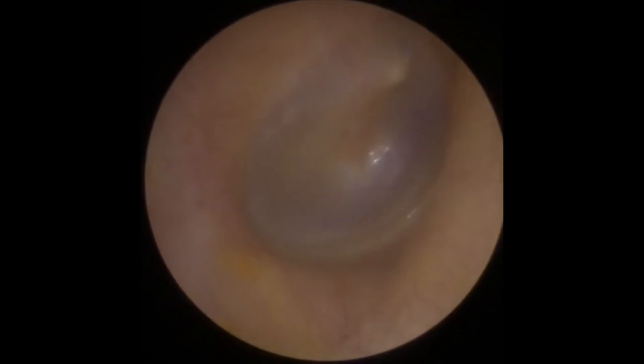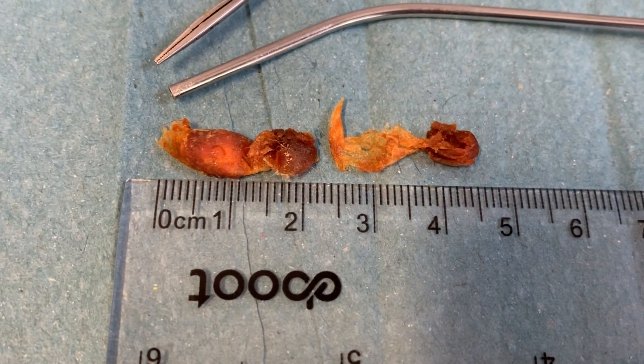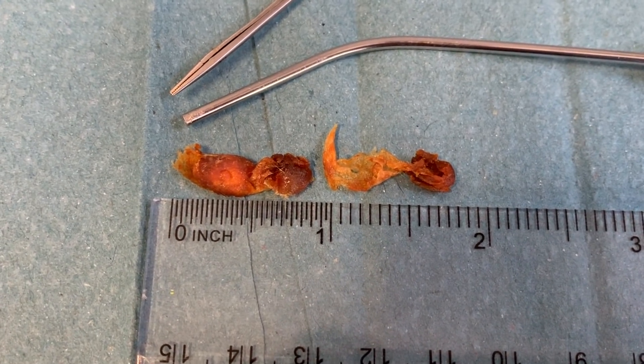There we go — there's another one. We've got a little leading edge there. Now you can see the very last bit of wax here. Those ribbons of skin had been holding this piece of wax much, much deeper in the canal. We're just taking that one away, and there we are — there's the eardrum looking nice and healthy. This is what we removed; a lot of the long bits of skin got sucked into the machine unfortunately, but these are the larger pieces we took away.